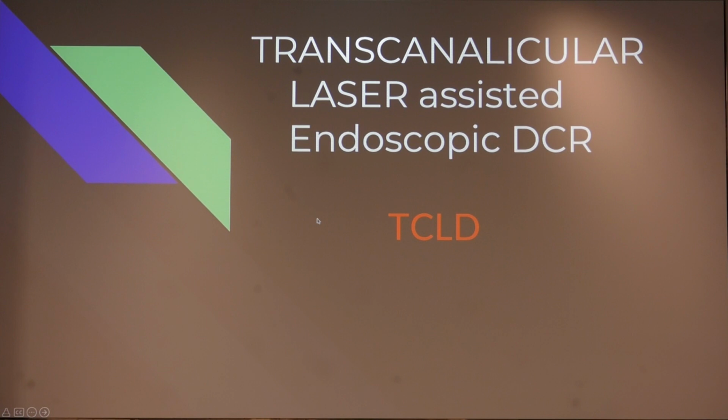More recently, minimally invasive techniques like transcanalicular laser-assisted endoscopic DCR have gained popularity. Now, what is this TCLD? Under endoscopic guidance, osteotomy is made with the help of diode laser. That's all.